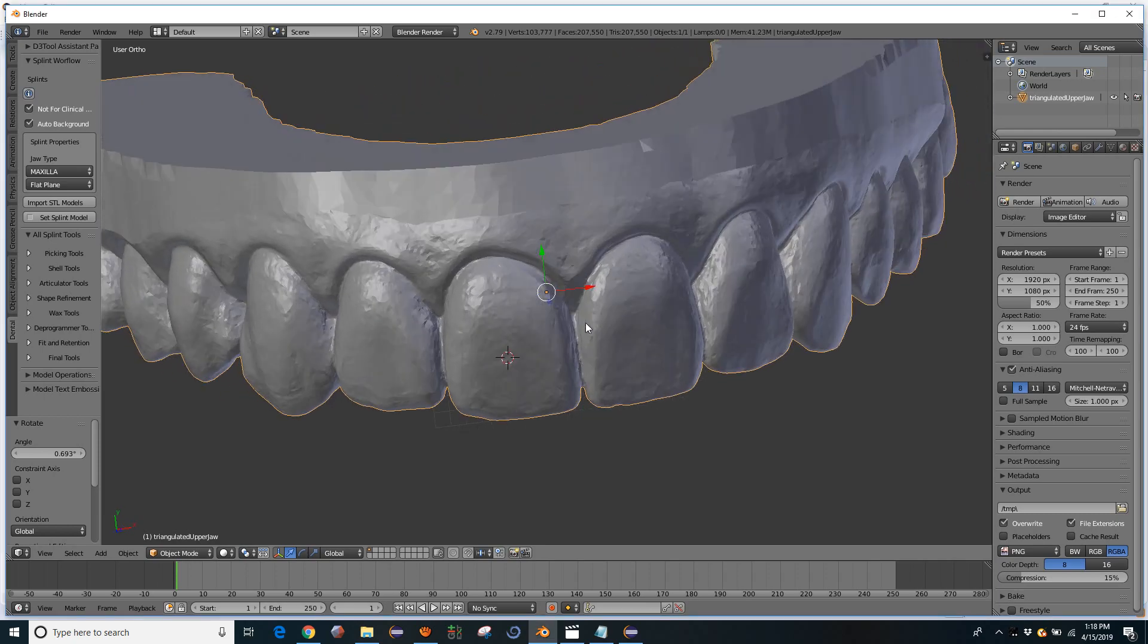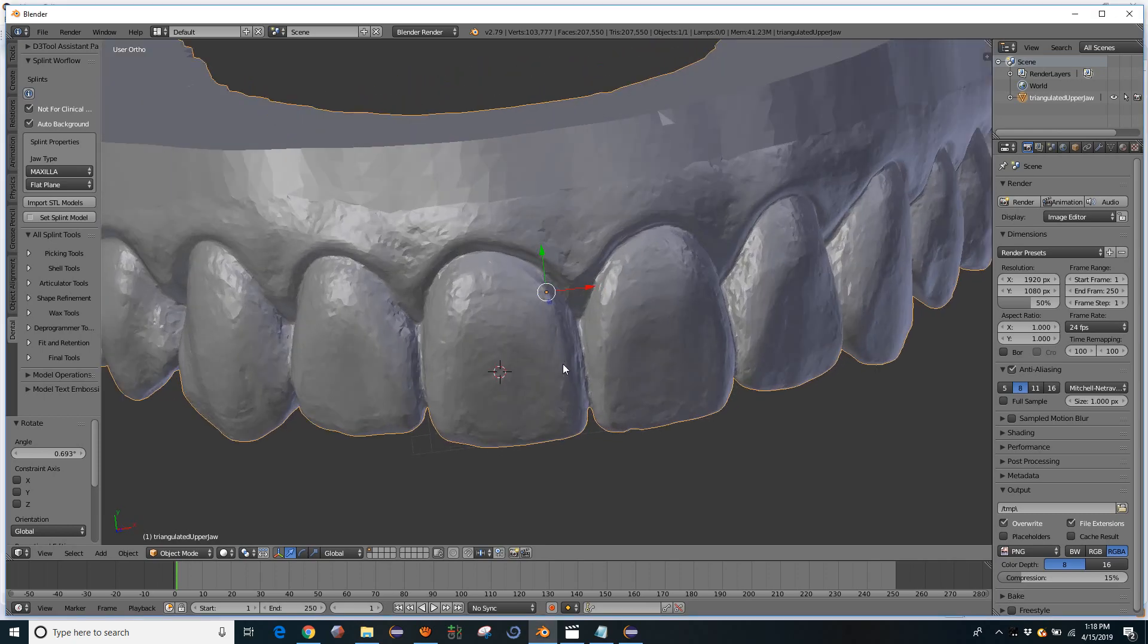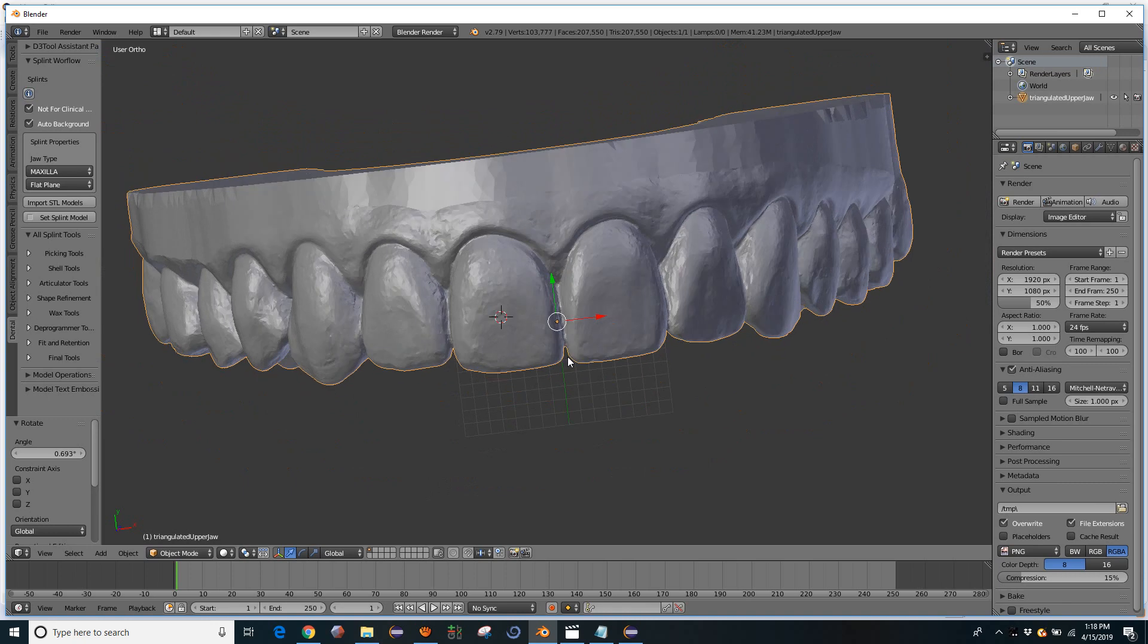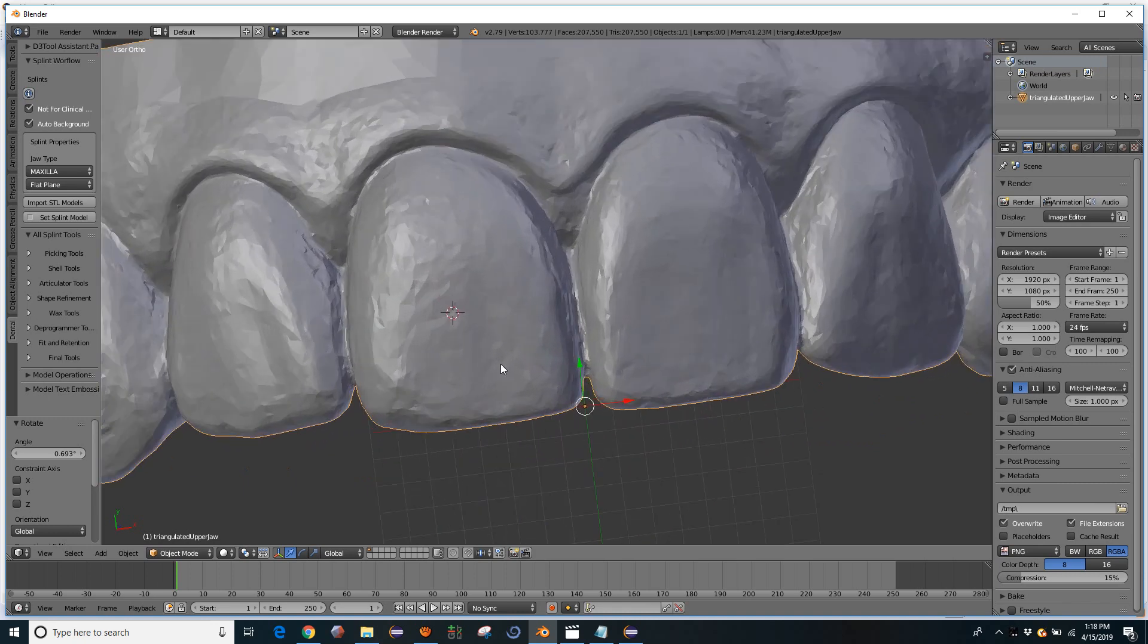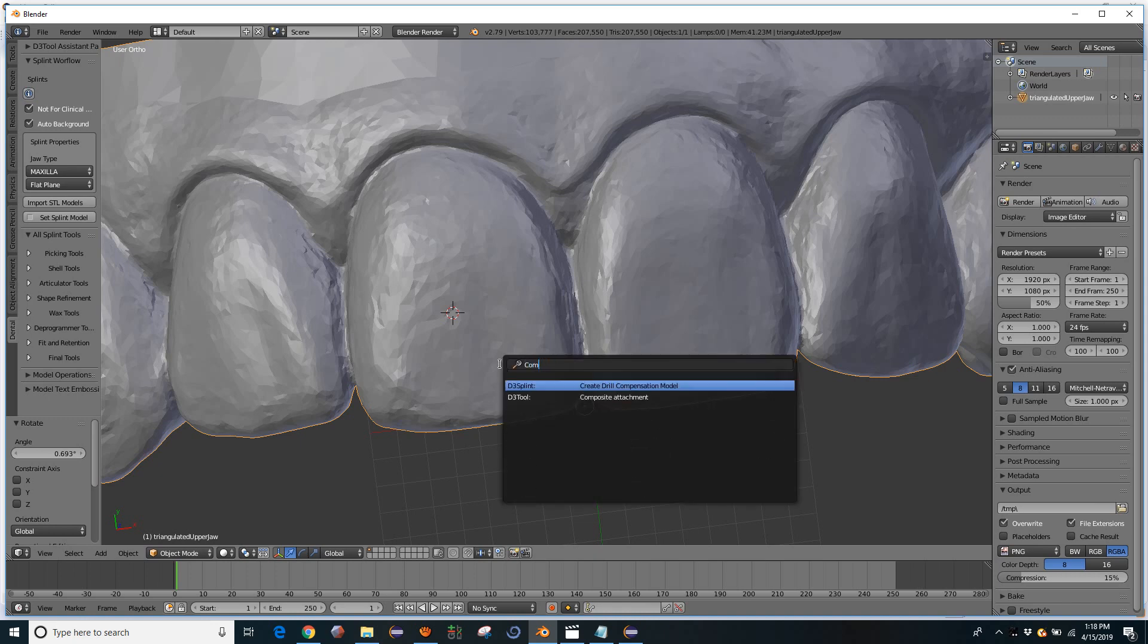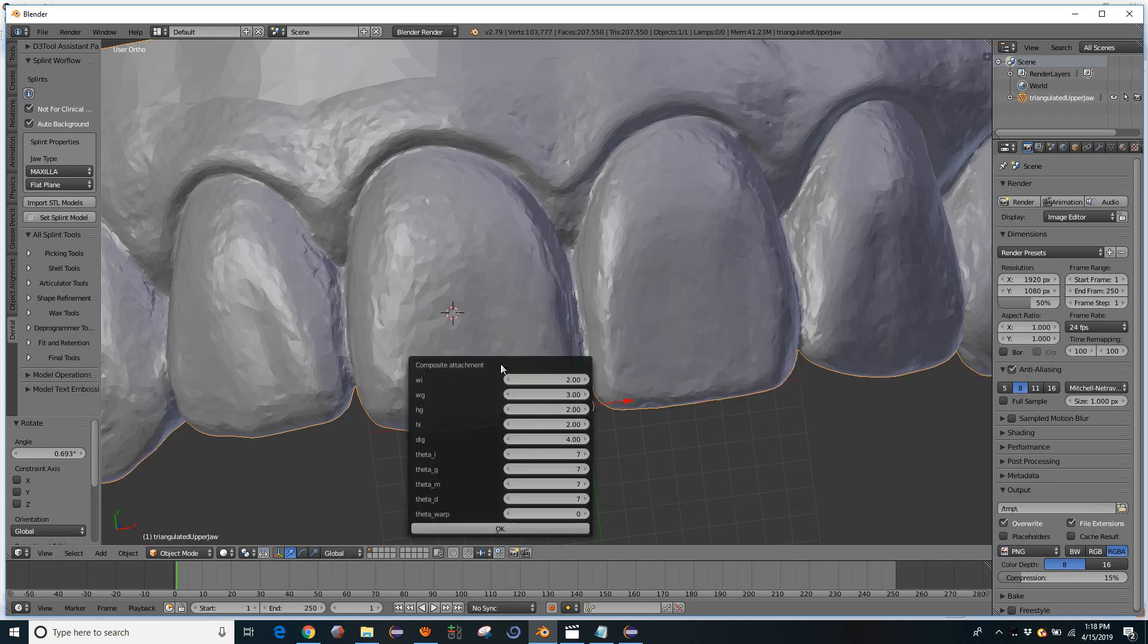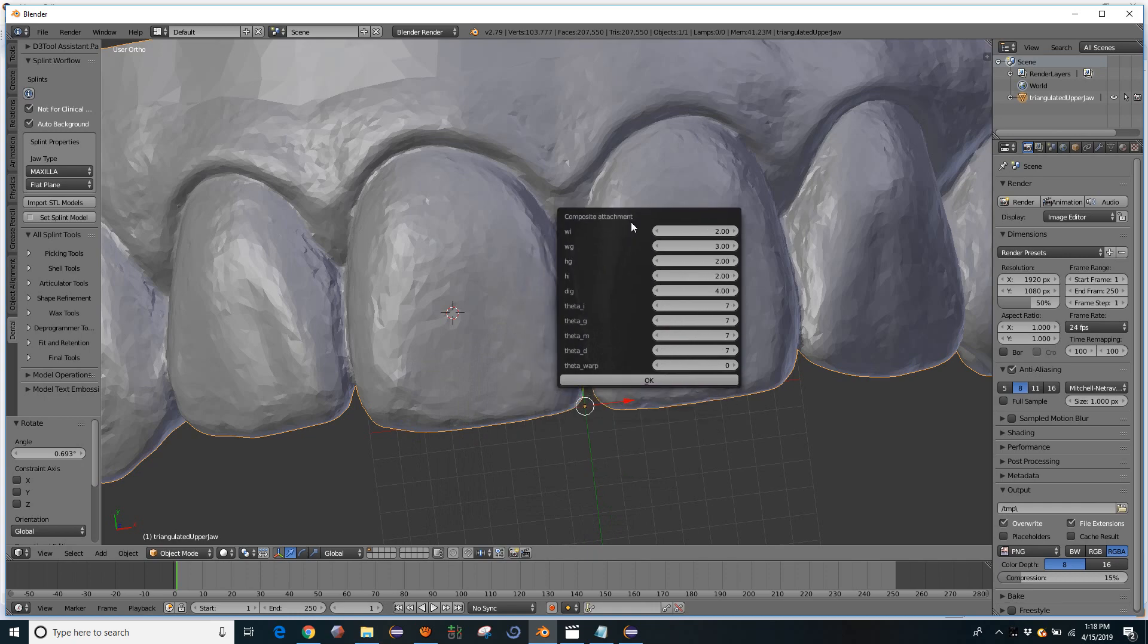I wanted to make a quick video about joining objects in Blender. At the same time, I exposed a little hidden Easter Egg that is tucked away in D3 Splint. It's called a composite attachment. It's basically a rectangular prism that you can then adjust a lot of the parameters on.